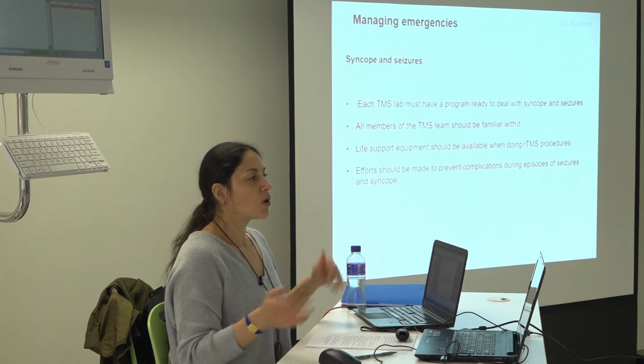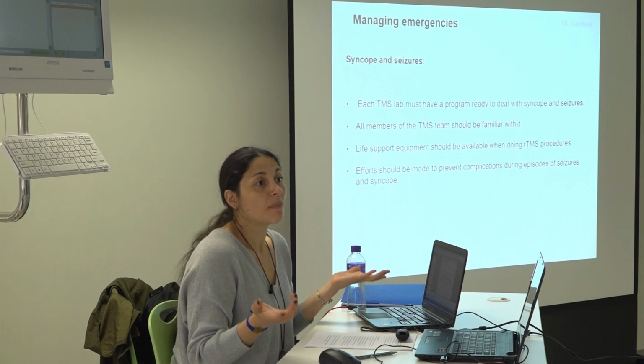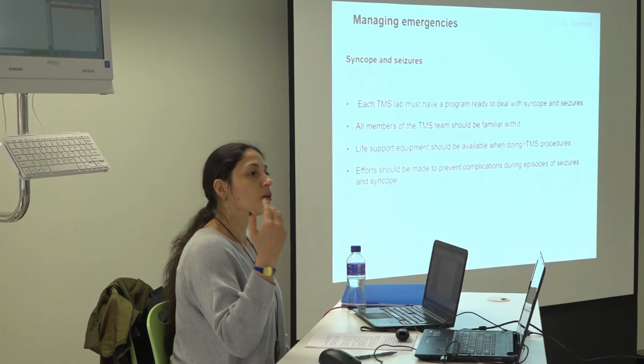After that, I said, no, I'm not doing more TMS. I do some testing on my own when I'm testing the studies. But I am not part of any type of TMS study anymore because I'm anyway a contraindication. It's a contraindication to have had a trauma and to have been unconscious. Yeah? When you have doubts, again, consult your neurologist or your associated doctor.